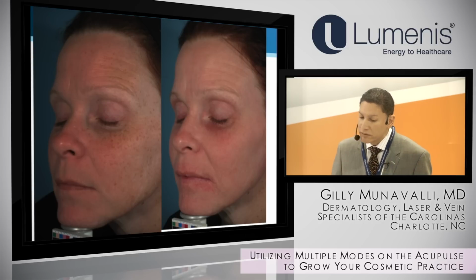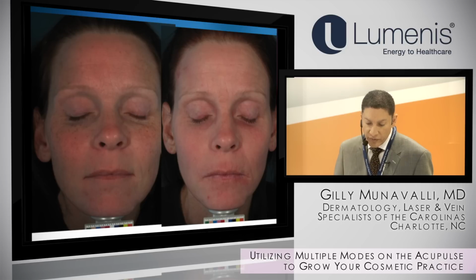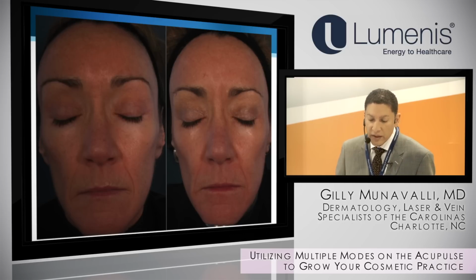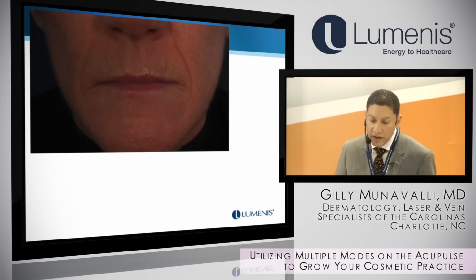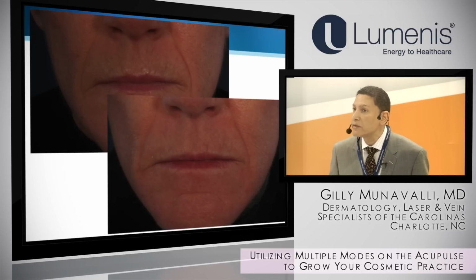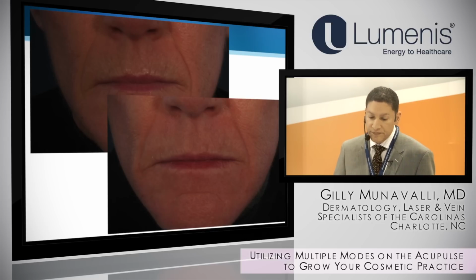She's a little pink. This is probably about six to 8 weeks out, but you can see the improvement in the texture and the wrinkling, and she was very happy with it. And this is her from the front. Again, you can see she's still healing from double passes around the eyes and the mouth, but this was a single treatment. This is another patient that had combo mode on, but we went a little deeper around the mouth. So we turned up the deep component on the combo mode around the mouth, but the rest we used combo mode at relatively non-aggressive settings. And here she is before and after, and you can see an improvement in the wrinkles. So this was, again, just with that combo mode.